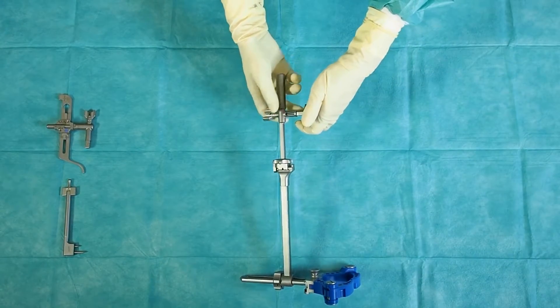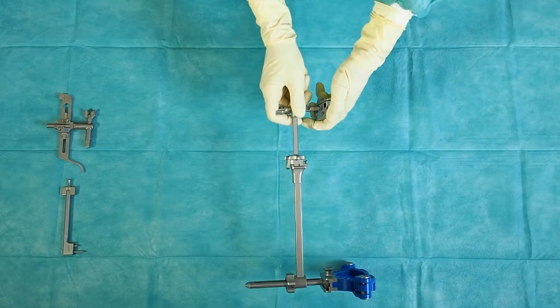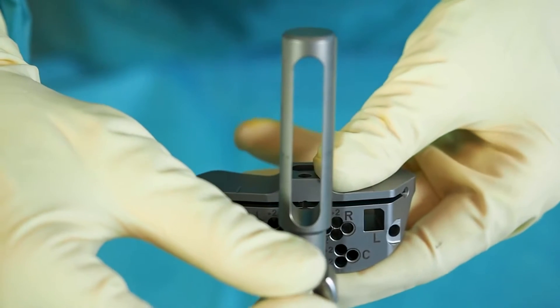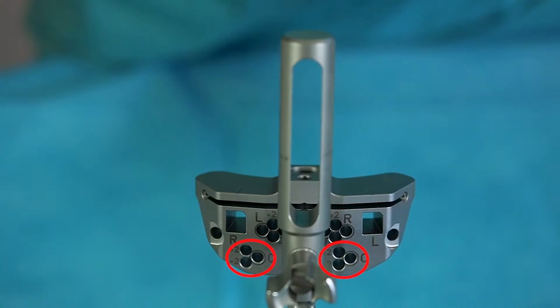For a standard approach, engage the holding rod in the central connection square of the tibia cutting guide. Lock the assembly by turning the frontal wheel. For fixation, the highlighted pinholes are used.